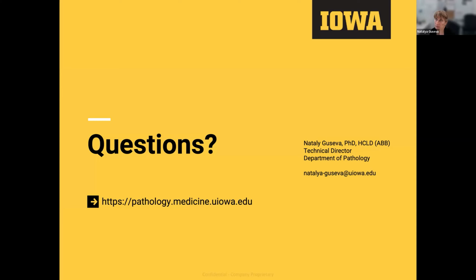VariantPlex, we had a limited experience, and for us, it didn't make sense because validation of pipelines was very intensive. We already have a validated approach for DNA calls.